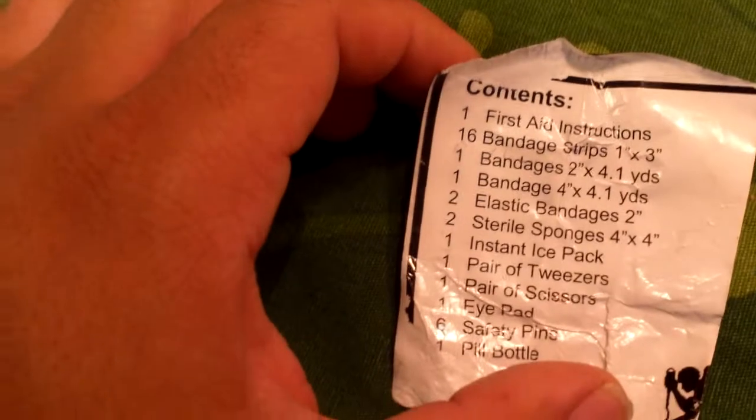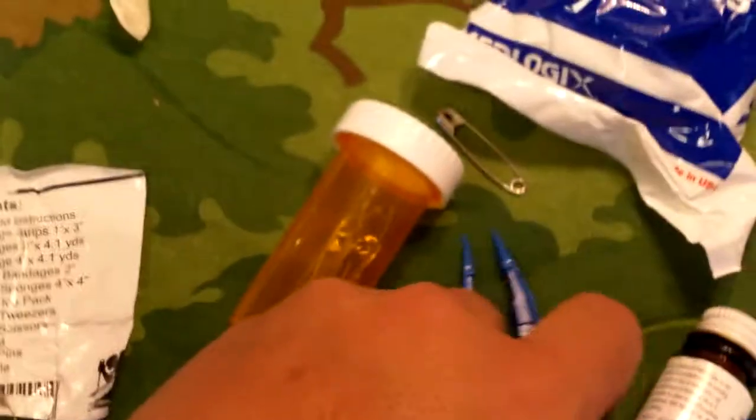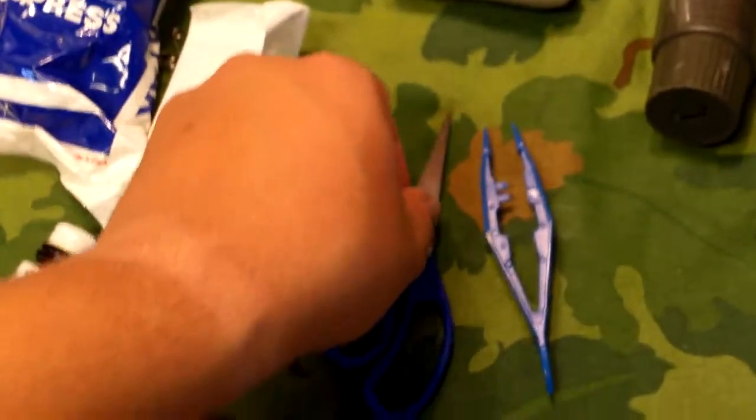Then you've got the gauze, and an instant ice pack — this right here. One pair of tweezers. And one pair of scissors.